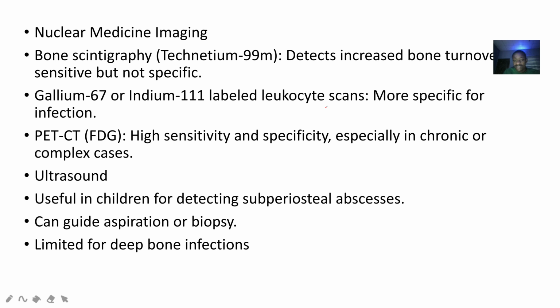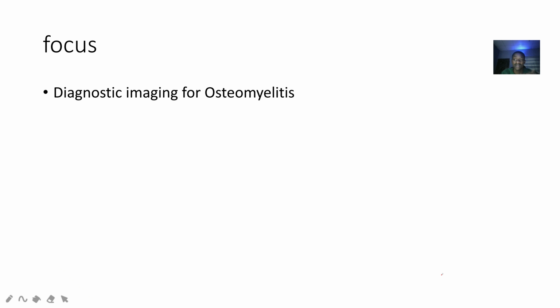Ultrasound is very important in children, and can guide aspiration and biopsy. As I'm putting my needle in to pick up some tissue, ultrasound is guiding me on the screen. So these are the various imaging modalities you might want to employ for osteomyelitis.